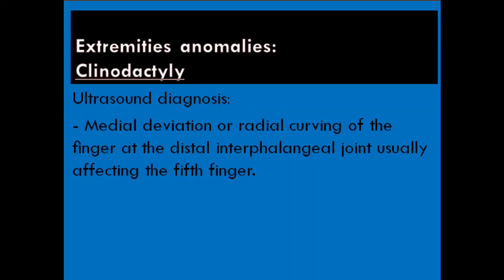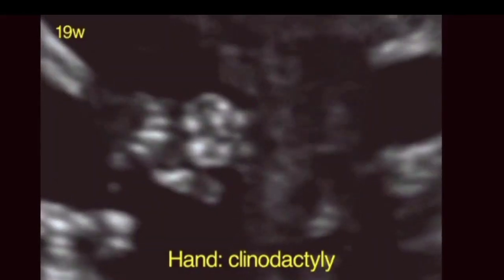The next abnormality is clinodactyly. Ultrasound diagnosis: medial deviation or radial curving of the finger at the distal interphalangeal joint, usually affecting the fifth finger.